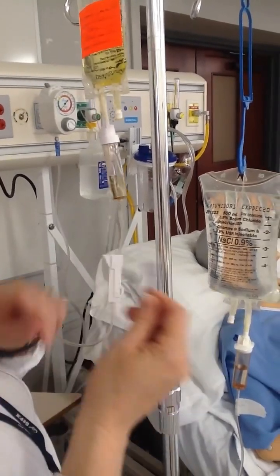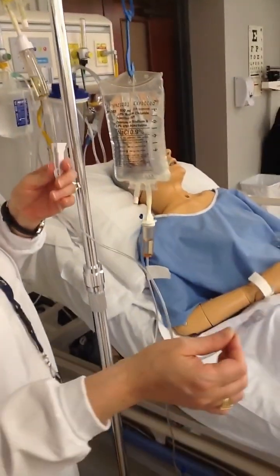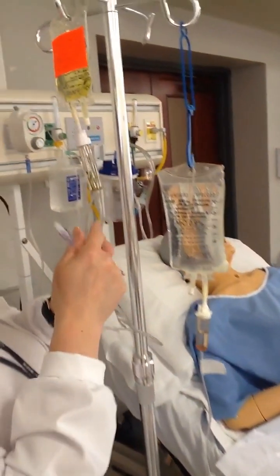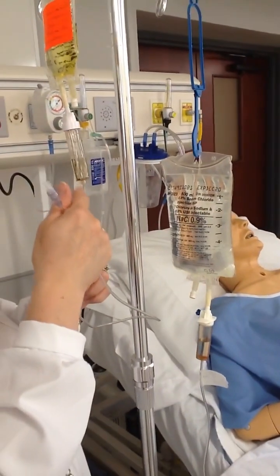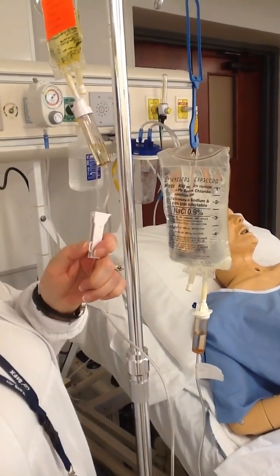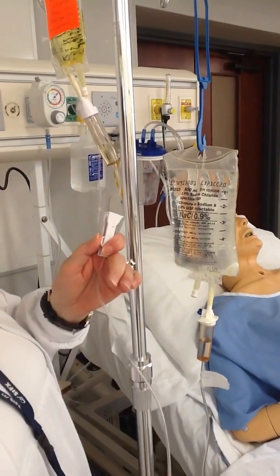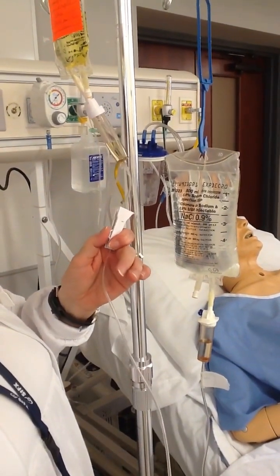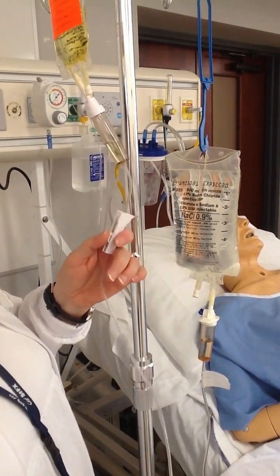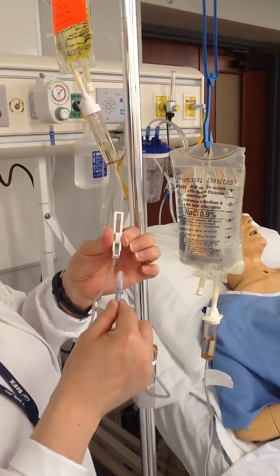Then I'm going to hold the tubing over a receptacle to catch the drops, and I'm just going to very slowly turn this roller clamp up, and you watch those drops and how quickly that just starts to fill the tubing and push the air out. So we're just going to slowly turn up the roller clamp. You can see, start right here. You can see how fast that went right through there, and it just slows down a speck as it goes through the roller clamp. You can see it coming right out of the tip there.